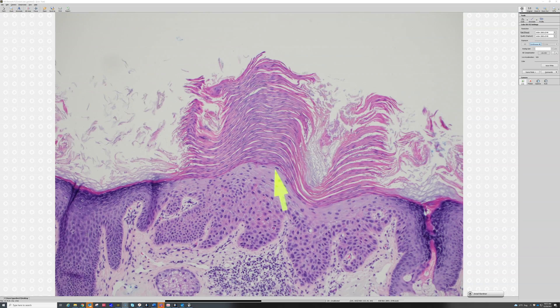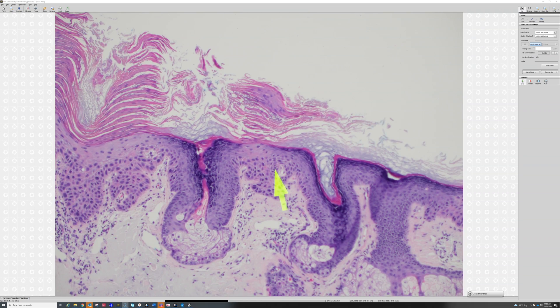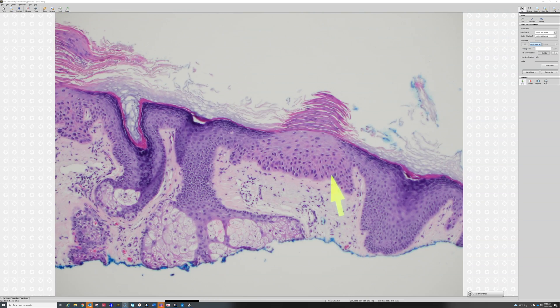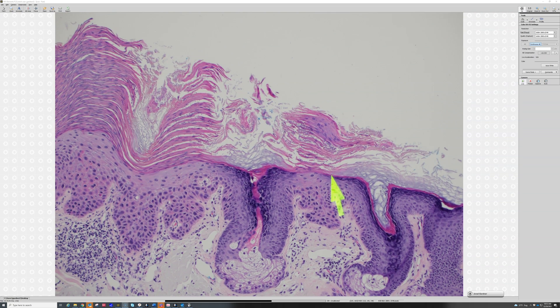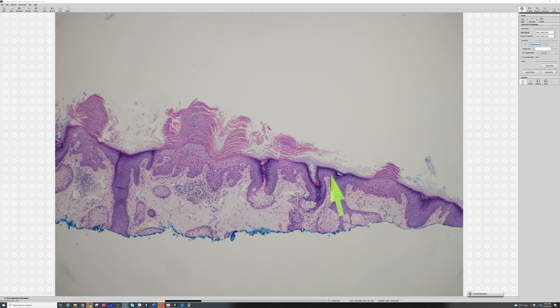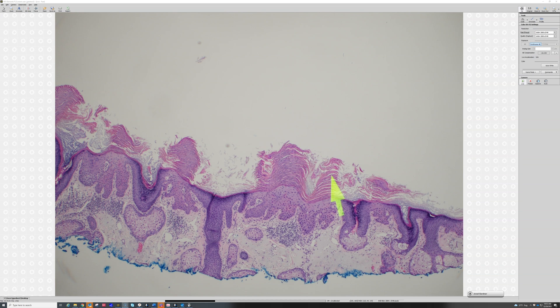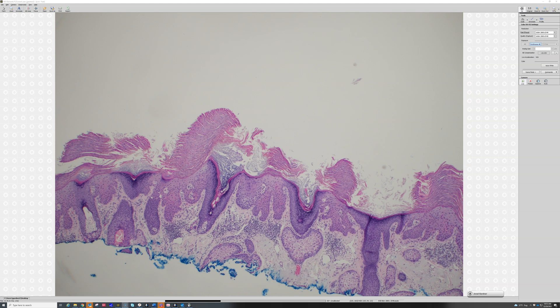Back to the AK — you can see it skips past this follicle opening, then there's more AK, then it skips past another follicle opening, and then there's more. That skipping or sparing of adnexal openings — hair follicle and sweat duct openings — is really characteristic of actinic keratosis. It produces an alternating pattern of columns of parakeratosis with areas of loose orthokeratosis in between, which some people liken to the appearance of a flag — they call it the flag sign. You particularly see it in actinic keratoses with a real thick layer of parakeratosis.